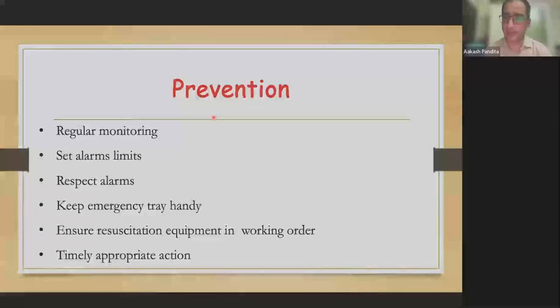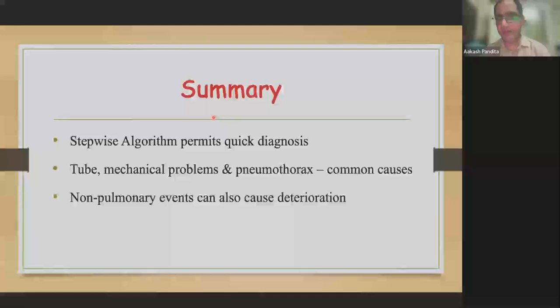We should always be ready for emergencies and keep the emergency tray handy. We should always ensure that the equipment is at the bedside, especially in patients who are sick and ventilated, and we should have a dedicated team to approach and a dedicated team to mobilize the things.